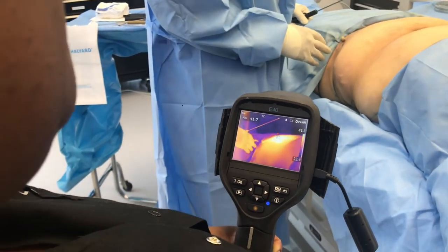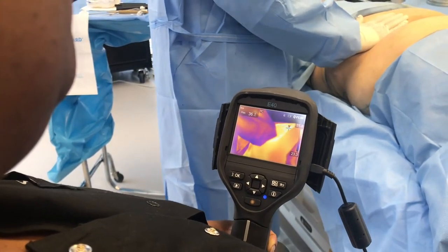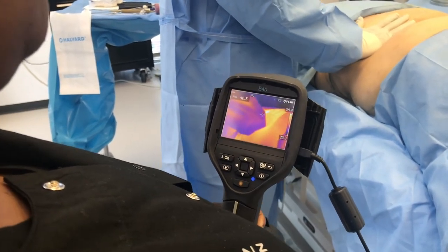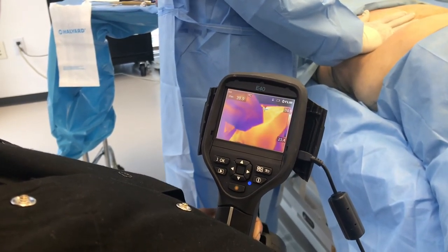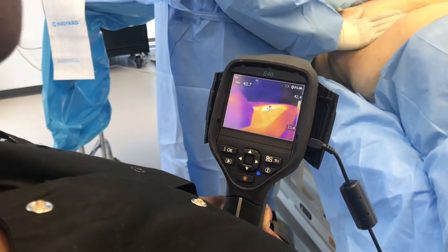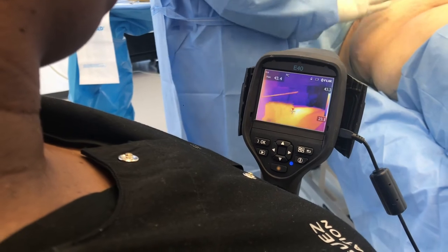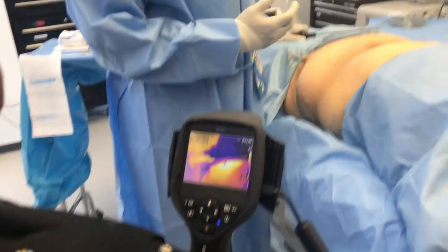What is our temperature now? 41.7. Once I finish one quadrant, I'll go on to the other quadrant on the other side so that we can get all the skin in the lower part of the tummy heated up satisfactorily — it ends up tightening more than with conventional liposuction. Temperature now? 43 — 44.5. So we've heated this up adequately. You can see it's a little rosy, a little pink, so we know that for several minutes this has been at the target temperature required for collagen remodeling.